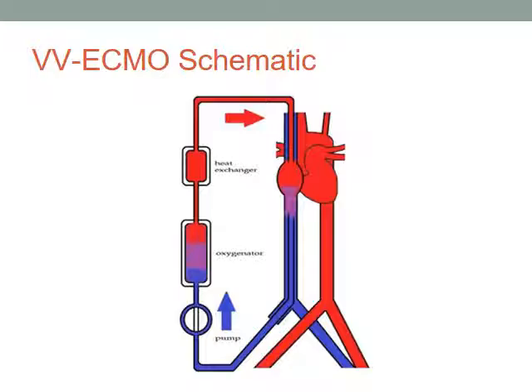This particular drawing, you notice that there's some blue lines at the top. The reason for that is blue blood that is coming in from above that has not become part of the oxygenator circuit.